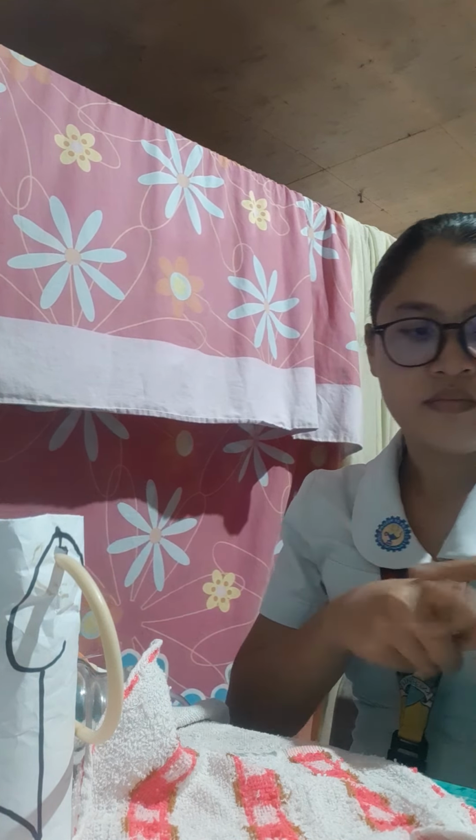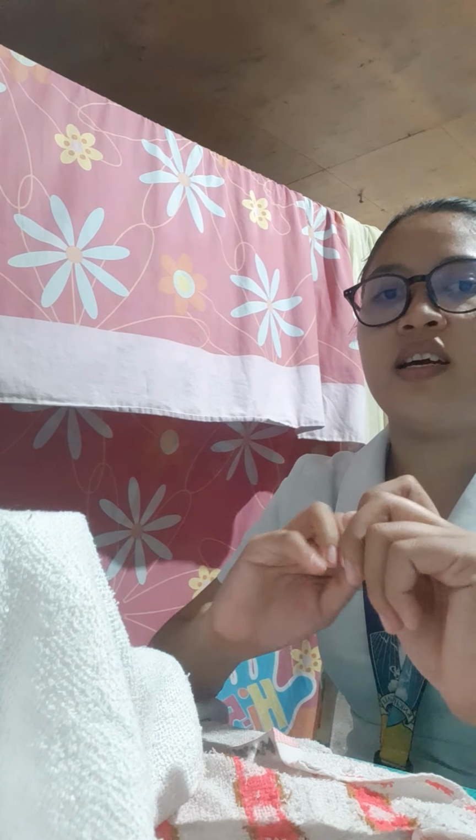Then for evaluation, we're going to inspect the condition of the urethra, note the character of urine, and assess the client's temperature. Then next we're going to record in the nurse's notes when catheter care was given, the assessment of the urethral meatus, and the character of urine. That's all. Thank you.